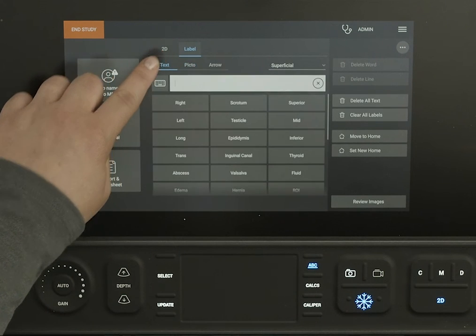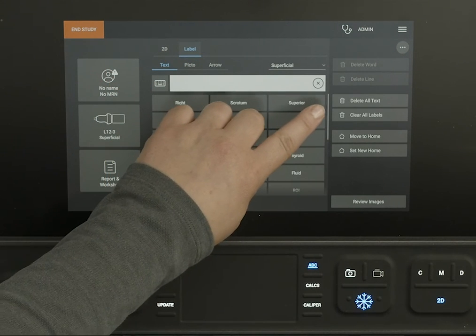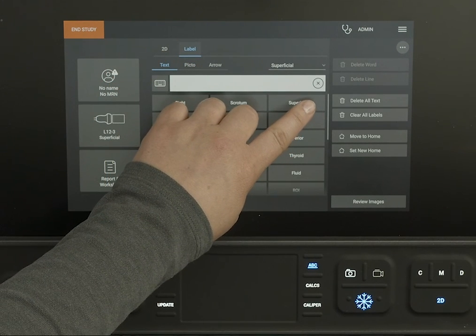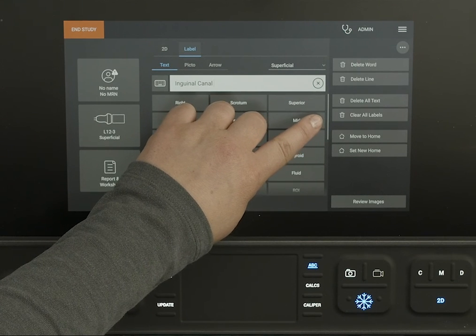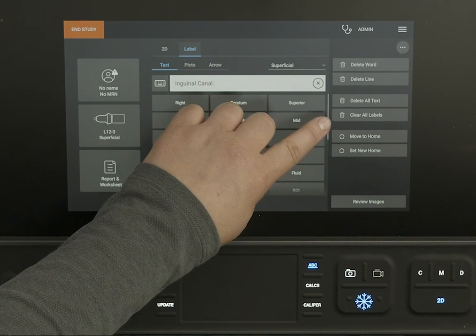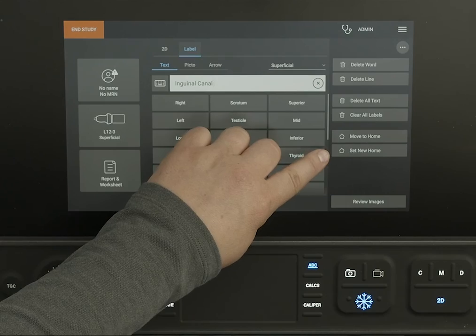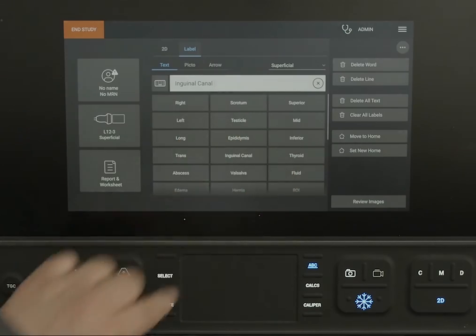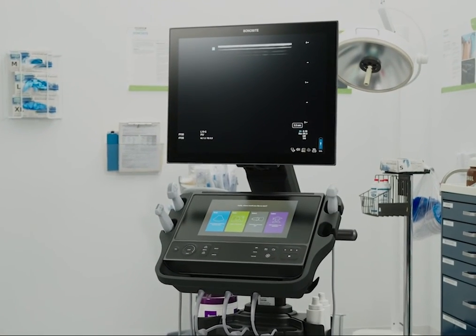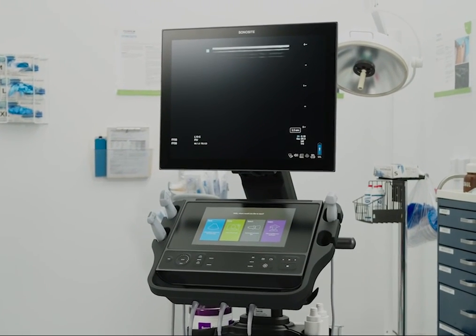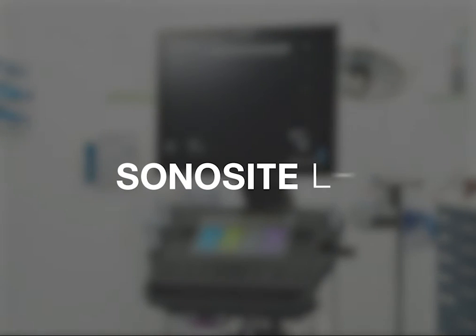You can delete all labels on the screen by tapping Clear All Labels, or you can delete just text labels. Other options include choosing a new home position for your labels. Now it's time for you to explore on your own. Watch the help videos or refer to the system user guide.